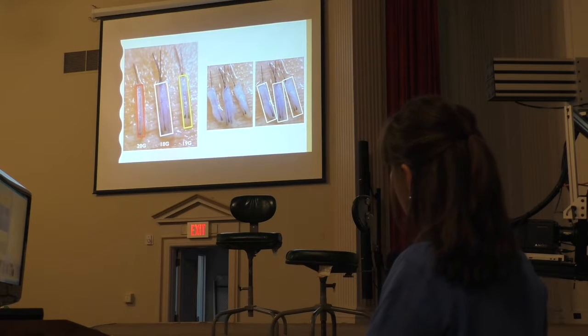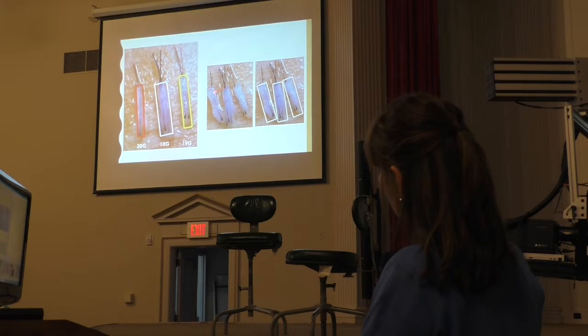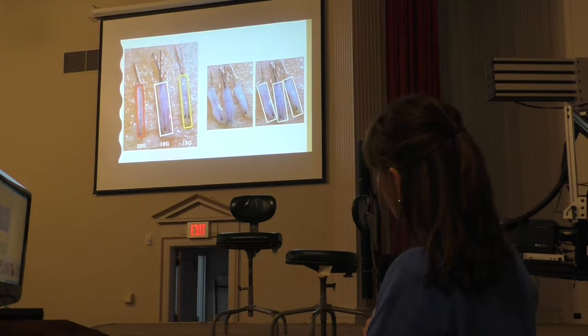If you make sites with the same tool, then your assistant should trim the grafts to the same size. For example, if I look at these grafts, the way they fit, they would fit in the same size site. But if I look at their hair content, once they're trimmed, this is a 1 hair graft, the middle one is a 3, and the other one is a 2 hair graft.